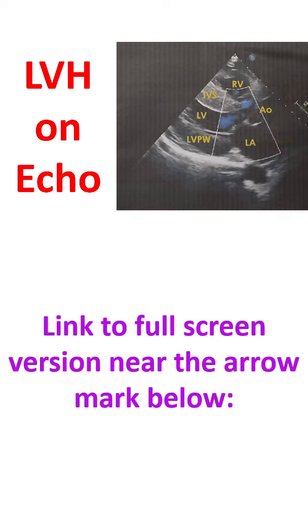This is the place where you keep the transducer. Free wall of the right ventricle. This is the right ventricular outflow region. Interventricular septum. You may note that the borders are seen much better than the inner part of the septum.